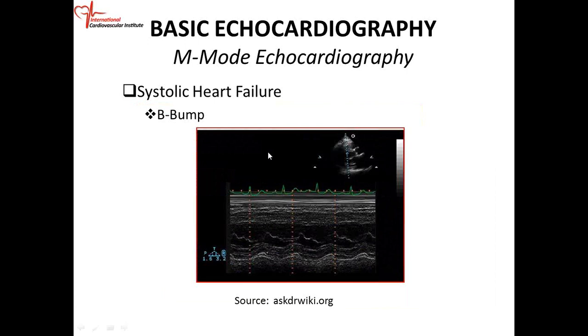So again, if you look at this M-mode, two-dimensional echo on top, cursors crossing through these structures. Again, the structures the ultrasound beam is looking at are the chest wall, pericardium, RV wall, septum, LV cavity with the mitral valve, okay, and either the posterior wall of the LV cavity or the left atrium.